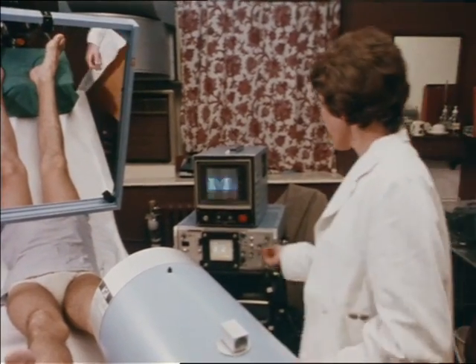Then we should be able to see exactly what we want to see on the screen. The red area shows clots are probably forming and treatment is needed. So thermography is not just pretty pictures, but a valuable clinical technique. It shows the body in a completely different way. It reveals the changes taking place within. And as our eyes are extended by techniques like this, it's not only our understanding of how our bodies work that will alter, our concepts of what we are may be transformed.